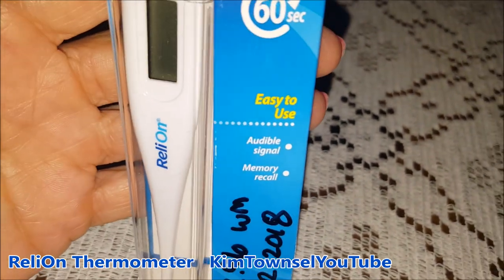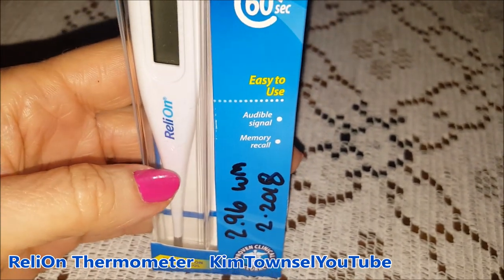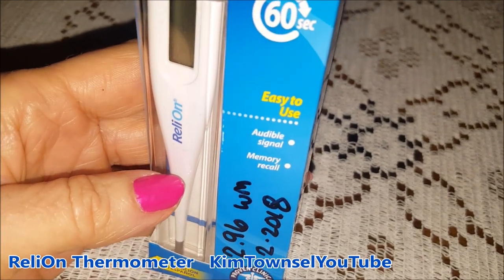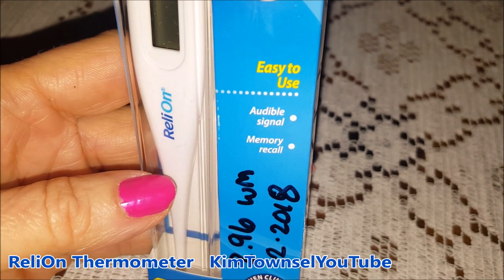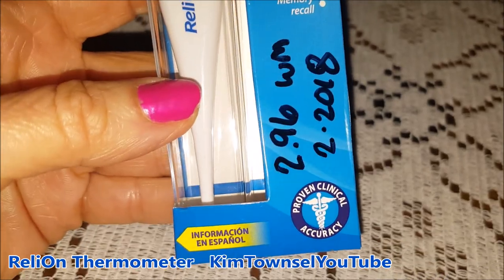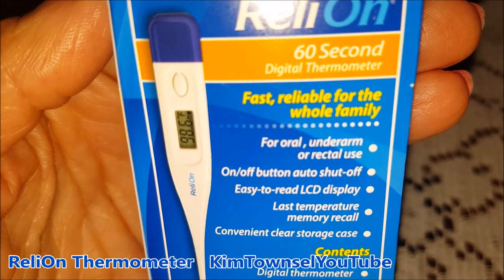It's called ReliOn. They had one that had more bells and whistles to it, but I just need something to check my temp in case I get sick or anyone else in the house gets sick. It's supposed to tell you in 60 seconds. It has an audible signal and a memory recall so you can tell what your last temp was. 60 seconds for oral, underarm, or rectal use.